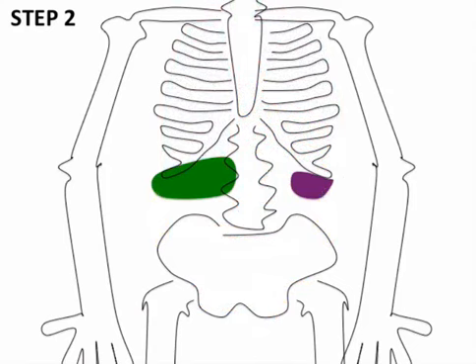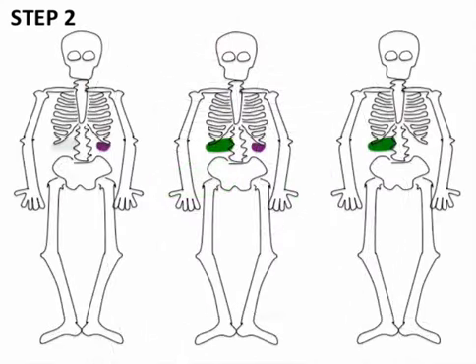So you basically have 3 scenarios. You've got a spleen and no liver. You've got a liver and spleen that are equal, and then you've got liver and no spleen. So either yes, tied, or no.